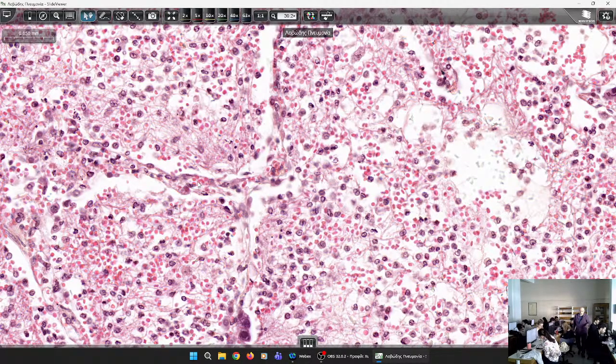Next, what characterizes the next step of inflammation? We have the formation of exudate. And where does exudate enter? It enters the alveoli. So instead of being filled with air, they are filled with the inflammatory exudate, and this causes problems. That means inflammation started to face the problem, but it causes problems itself.